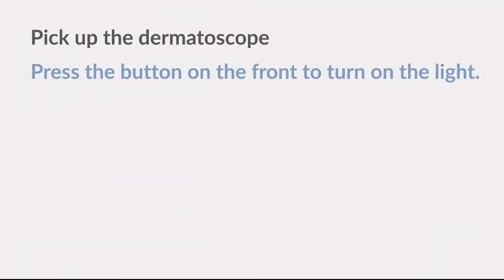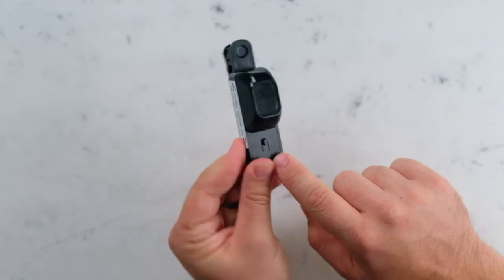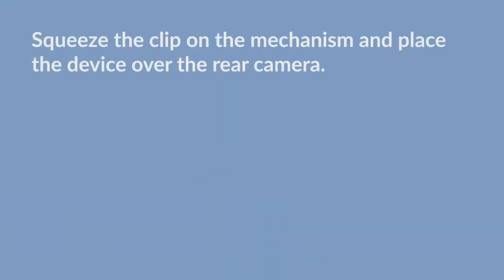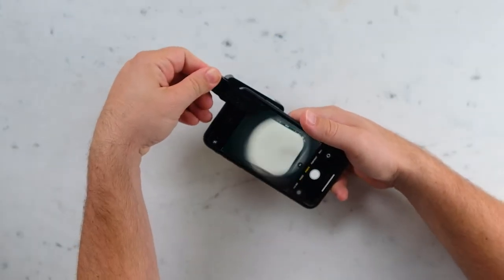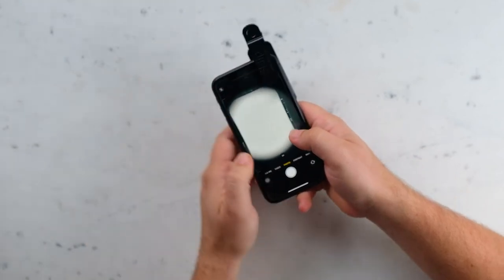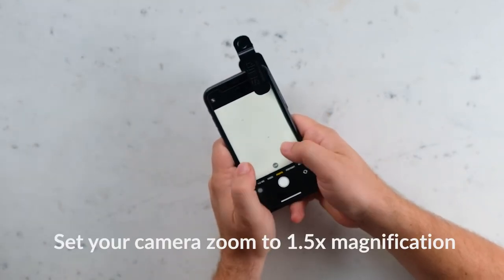Remove the dermatoscope from the foam packaging. Press the button on the front to turn on the light. Squeeze the clip-on mechanism and place the device over the rear camera. Center the device. Set your camera zoom to 1.5 times magnification.